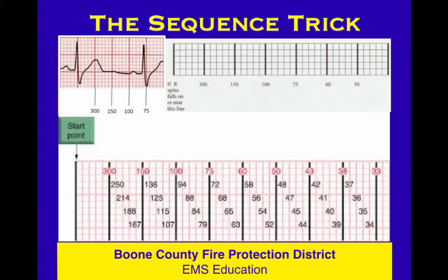So you can go to that level if you want, but really rate is the most important thing on EKG, and we'll say this about 300 times before this course is over. But you know, it doesn't really matter what the rhythm is. It matters what rate that rhythm is producing. It doesn't matter that the patient's in 2nd degree type 2 block if the ventricular rate is staying in the 60s or 70s. That's probably making a decent blood pressure. So rate is the very, very most important thing.